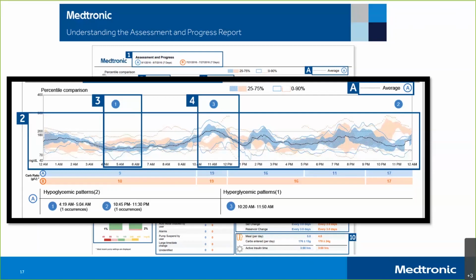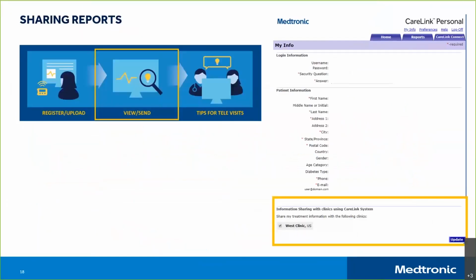Sharing that, Rhonda, it helps to see how I'm doing over time. Rhonda, what are some ways I can get these reports to my healthcare provider?